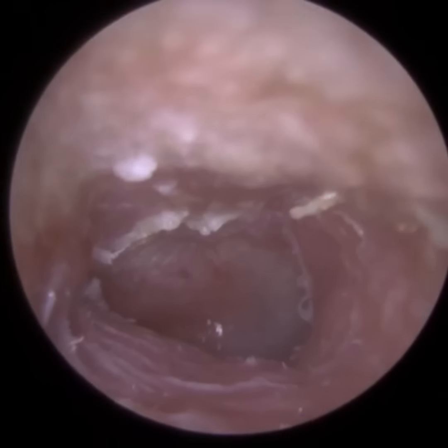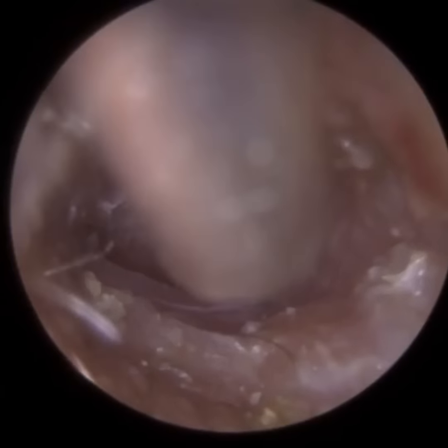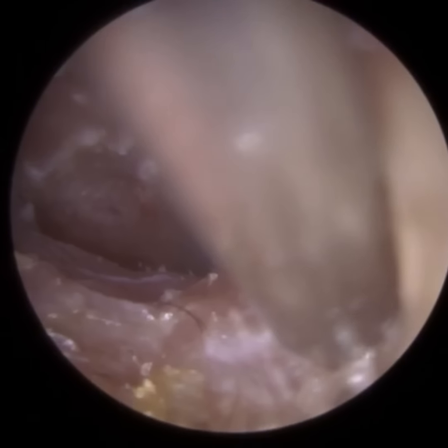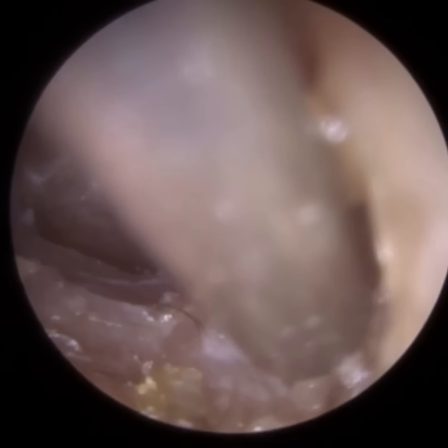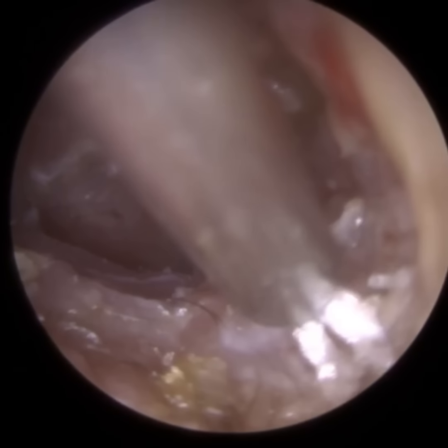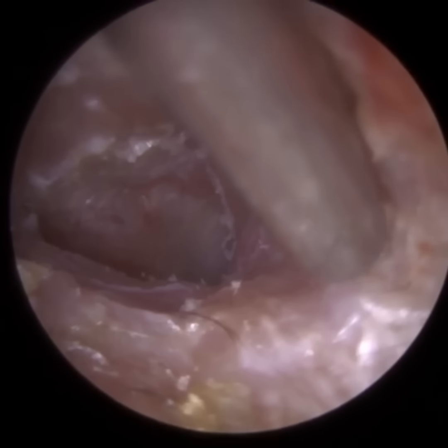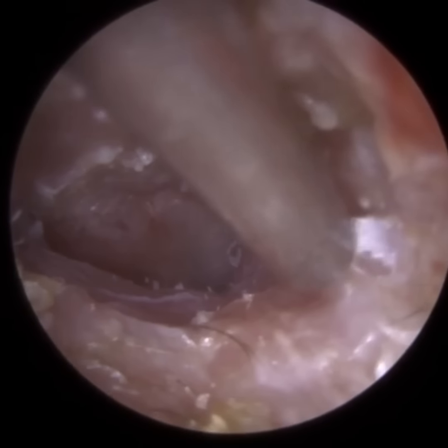So the patient's been advised not to use cotton buds, not to get water in the ear, written to their GP to get some medication for this, and after which they're going to use sodium bicarbonate drops on a weekly basis and attend in 6 months just as a routine appointment as a follow-up. So just some dead skin here. Just want to see if that will remove, but it won't.